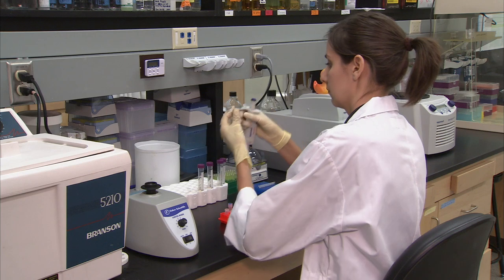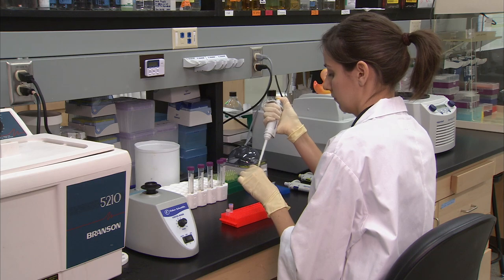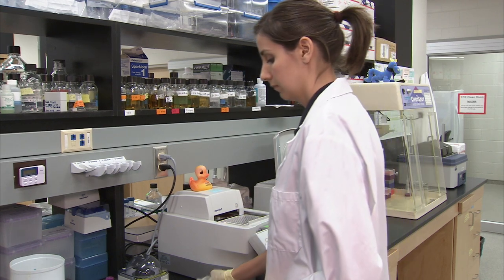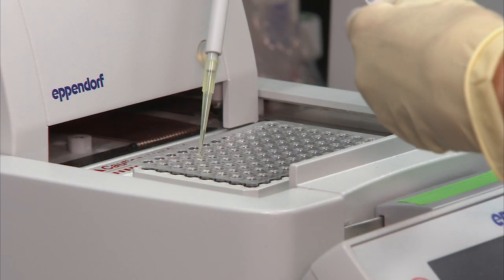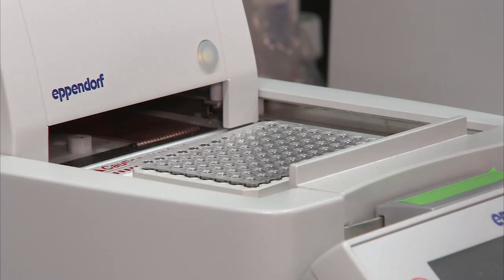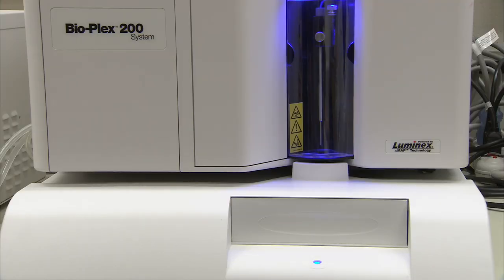Make fresh streptavidin phycoerythrin solution — you will need 25 microliters per well. Dilute the stock at 1 milligram per milliliter, 1 in 50, to 20 micrograms per milliliter with 1x TMac buffer. When the thermocycler reaches the 60 degree hold step, open the lid, remove the silicone cover, and add streptavidin phycoerythrin solution directly to each well. Replace the silicone cover, close the thermocycler lid, and resume the program. When the program is complete, quickly transfer the plate to the Bioplex machine to read within 10 minutes, at 60 degrees. Ensure that the Bioplex has been pre-warmed to this temperature.